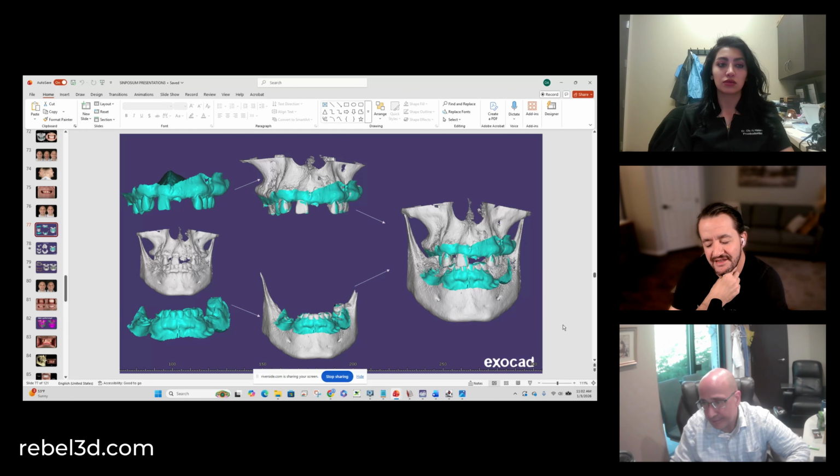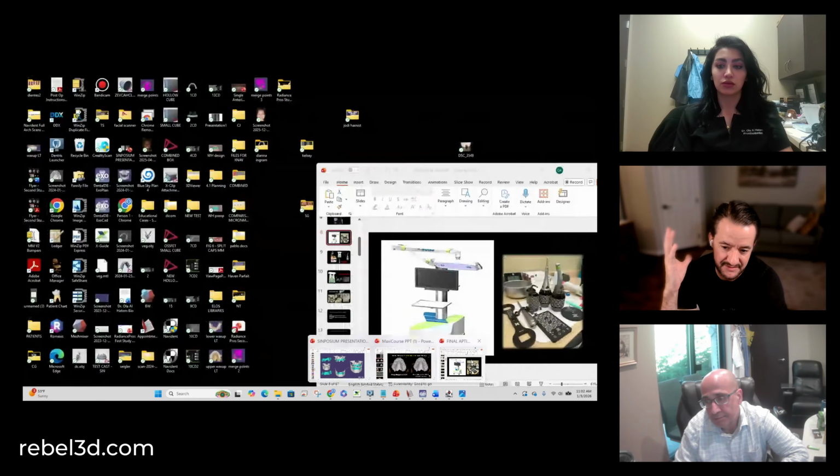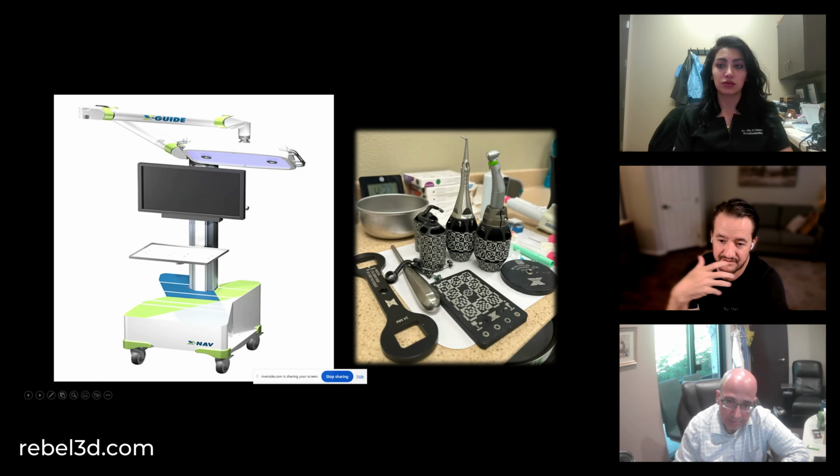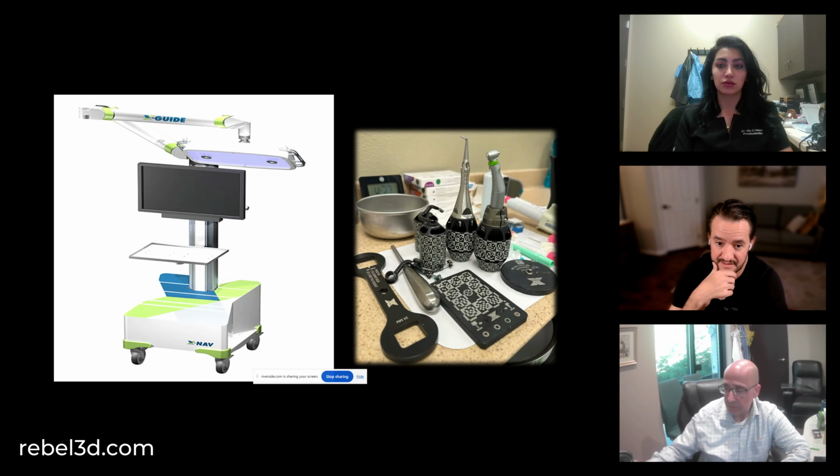Well, talk to us about the jaw tracker, Dr. Ola, that you said you're using. So the X-Nav is mapping the jaw, and if the patient's moving around, there's a tracking device that you fix to the jaw to make sure everything is stable, right?